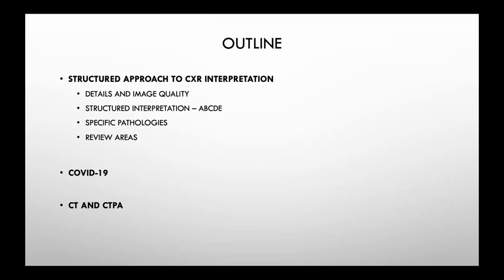So the outline of the presentation, it's a structured approach to interpreting a chest X-ray, a brief bit on COVID-19, and then CT imaging. There's really only a brief bit on CT imaging because I don't think it's important for the kind of general medic or the general surgeon or anyone on the shop floor really to know. That's for our radiology colleagues to report.